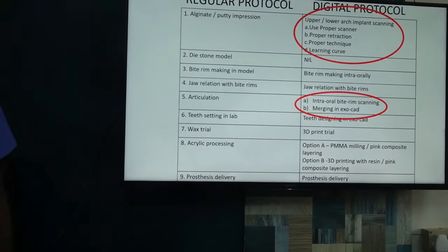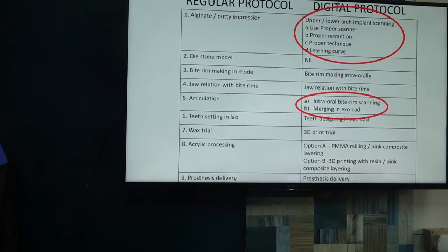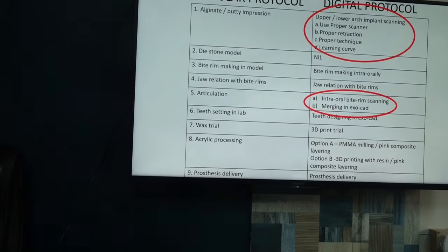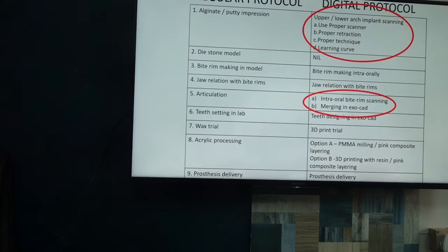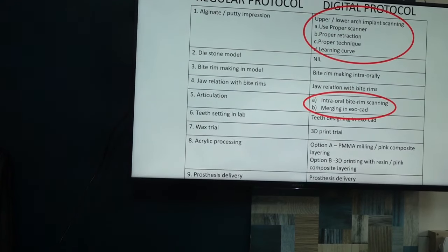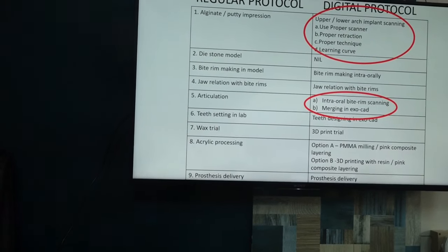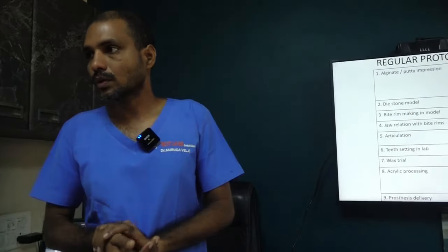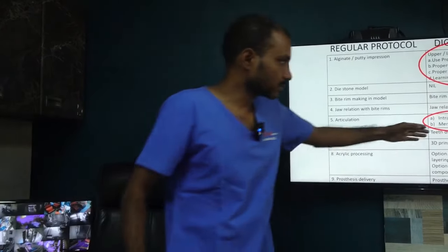Then after fixing and all, it is the same. Actually, it becomes easier than the acrylic processes. The fitting becomes very easy. For the bite itself, you don't need that much trimming. Many times we do a lot of bite balancing in acrylic processes. Almost we remove all the molar teeth, or sometimes we keep the upper and redo the lower. But after starting this digital work, those things are not happening. So actually these steps become easier.